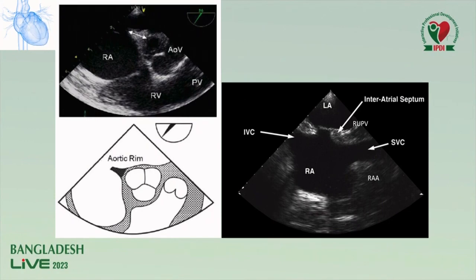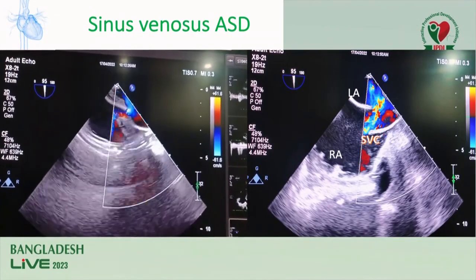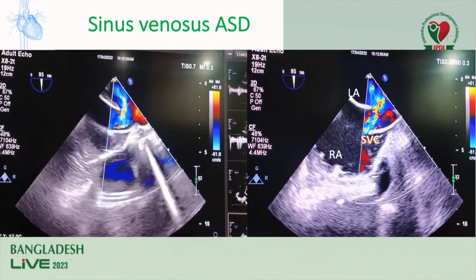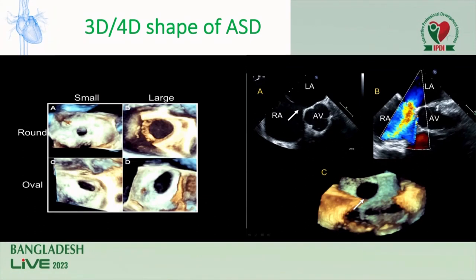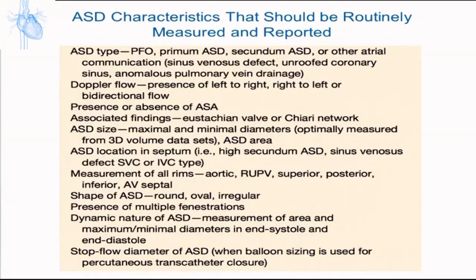This is a retro-aortic rim. This is a sinus venosus type ASD. Unroofed coronary sinus shows shunt from left to right atrium through the coronary sinus. This is the 3D or 4D shape of ASD — round or oval, small and large.